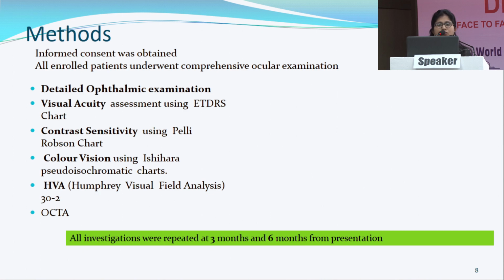Informed consent was obtained and all patients underwent detailed ophthalmic examination including visual acuity, contrast, color, Humphrey visual fields and OCT angiography. The investigations were repeated at 3 and 6 months.